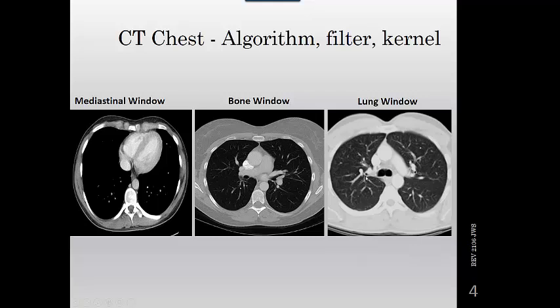So here, if you look here, this is a bronchus coming out. It's an air-filled bronchus. You can see it there, and then you've got the vessels of contrast all around it. The easiest way to do that too is to find the trachea where it's bifurcating at the carina. Follow it out, and you'll find these bronchioles going out into the lungs, and you can see the vessels, the bronchial walls, and things like that when you window it down.